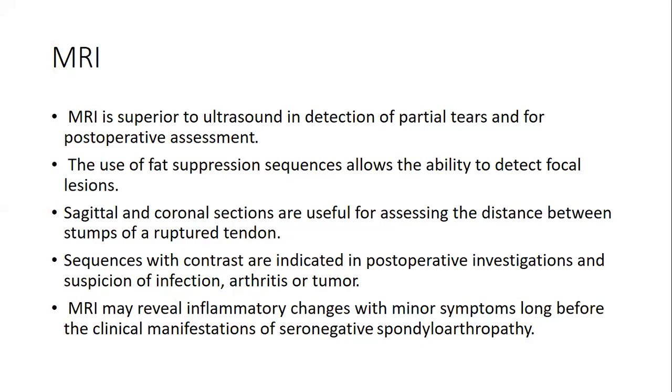Sequences with contrast are indicated in post-operative investigations and suspicion of infection, arthritis, or tumor. MRI may also reveal inflammatory changes with minor symptoms long before the clinical manifestations of seronegative spondyloarthropathy.